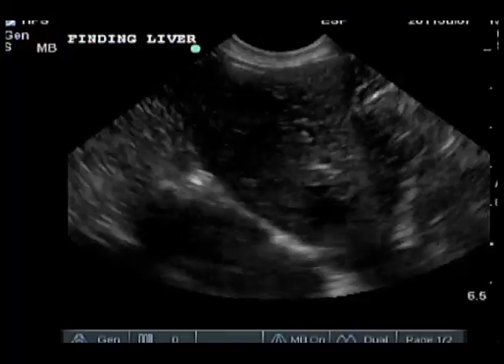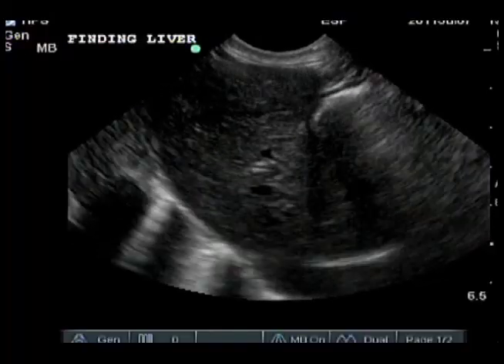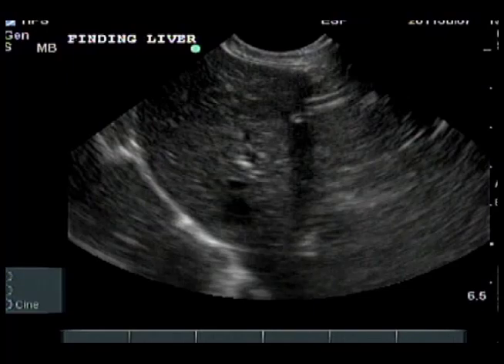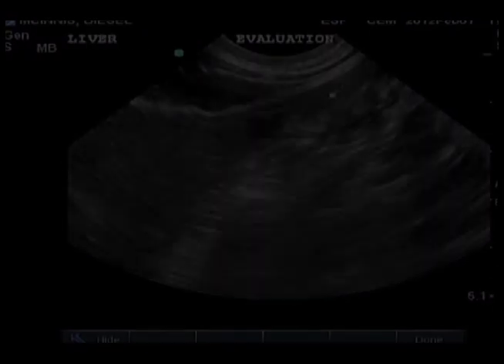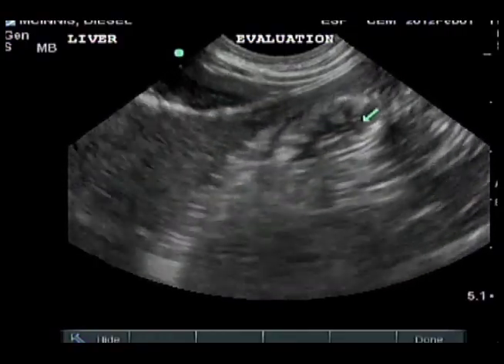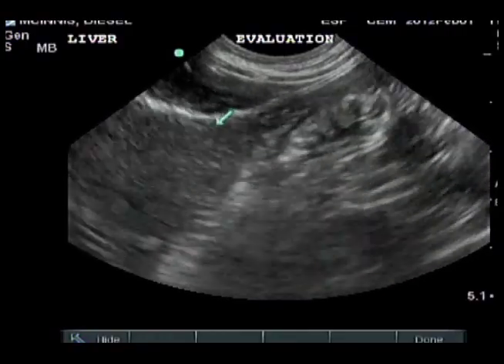When the diaphragm is on the left side of the ultrasound screen, the normal liver fills about half of the screen. This guideline only applies for a patient in dorsal recumbency. The liver should not extend over or beyond the stomach.